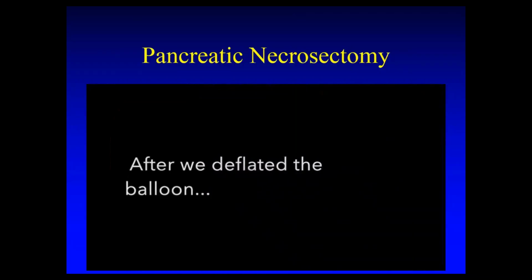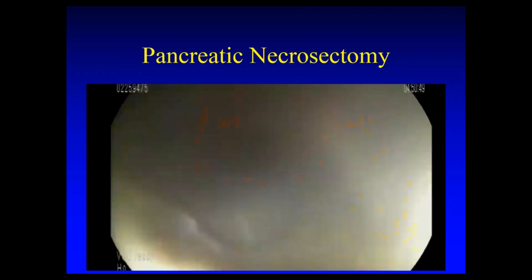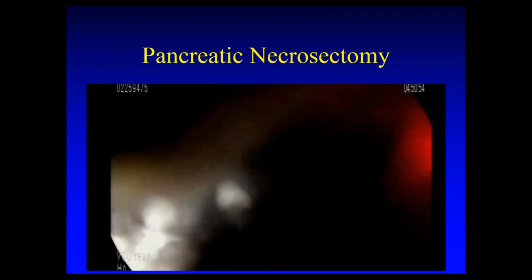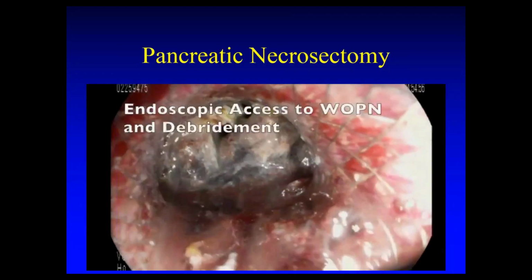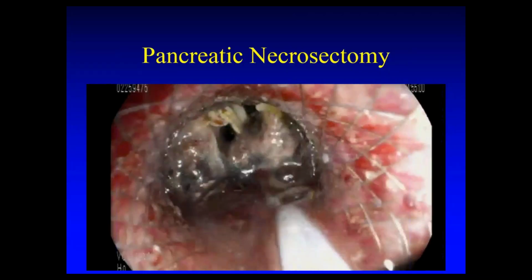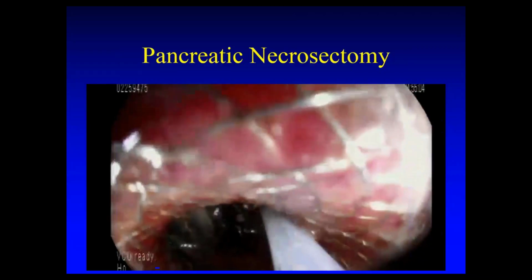Now, we don't have to finish the entire necrosectomy all at once. Once the stent is in, there is access to this cavity that you see here. We can bring the patient back every 2-3 days for debridement until the cavity is clean. I think this patient might have come back 2 or 3 times over a 10-day period.